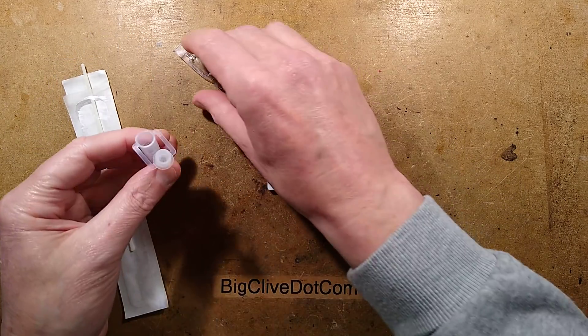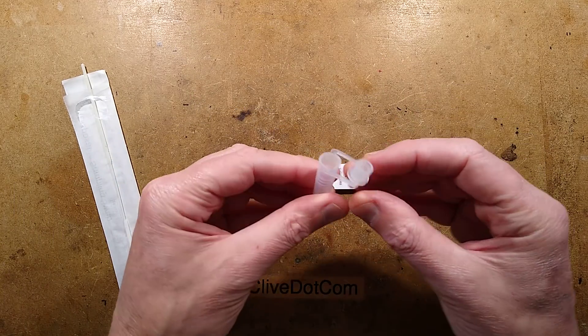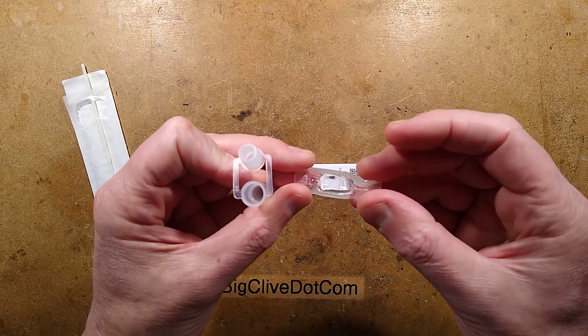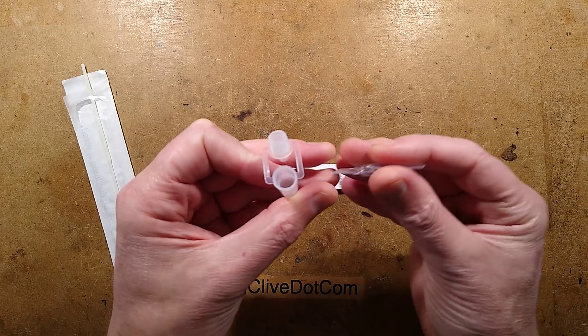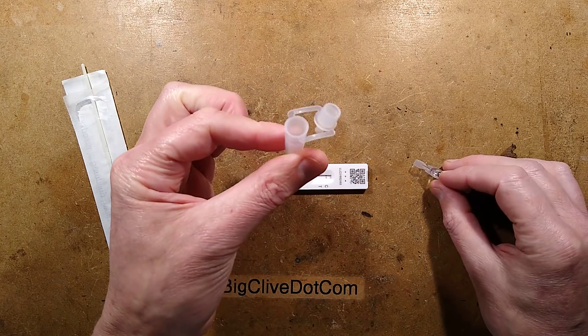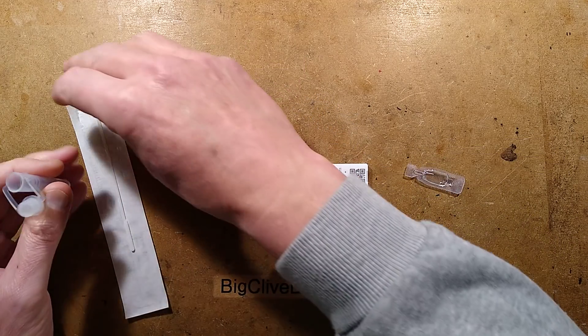So to do the test, you get these little dropper bottles and you get a carrier solution here. You snap this off and you pour the small quantity of carrier solution into this bottle.